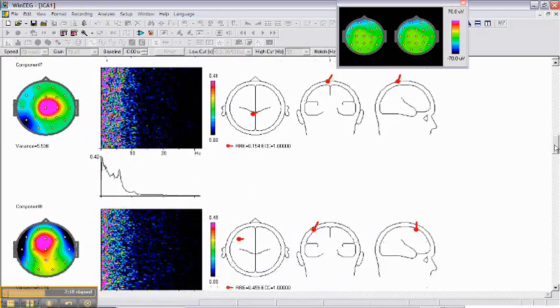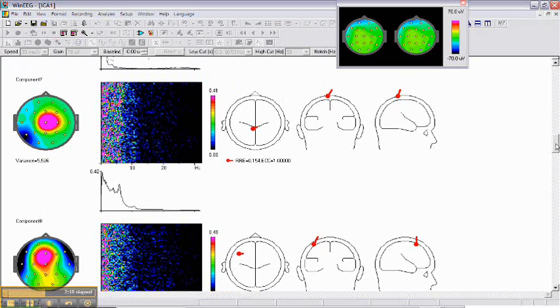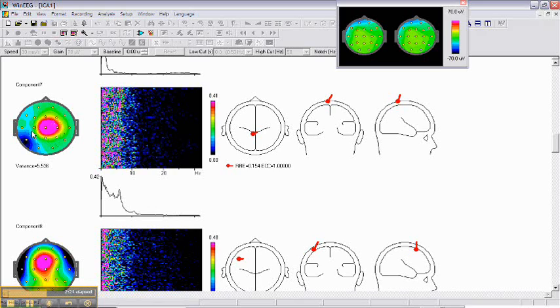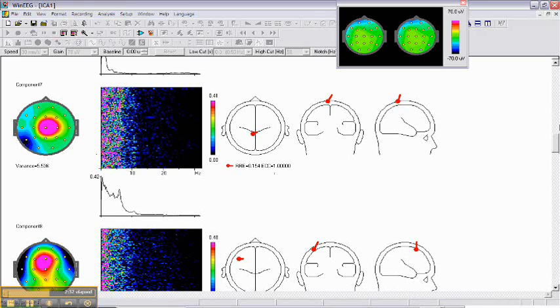This is a component that corresponds to occipital alpha rhythm. And this is a component that is generated over the central area which was deviant from normality in this patient.